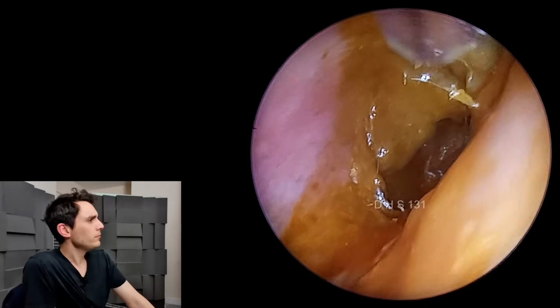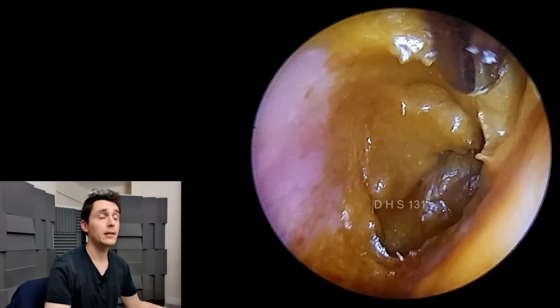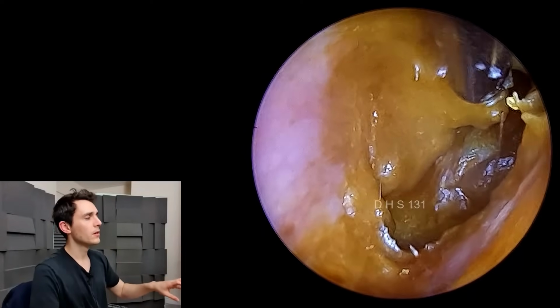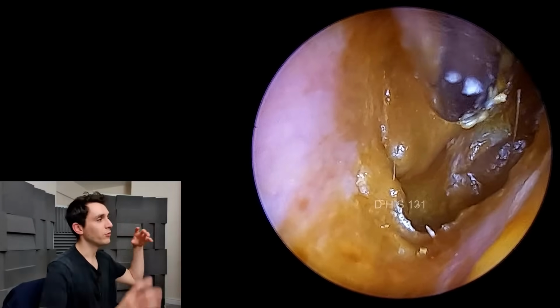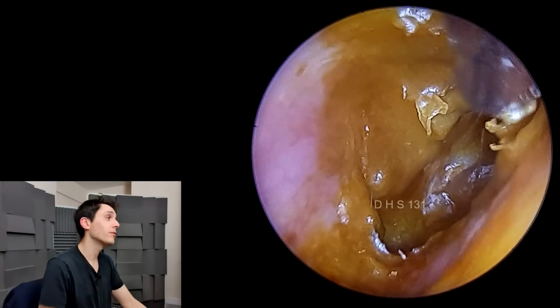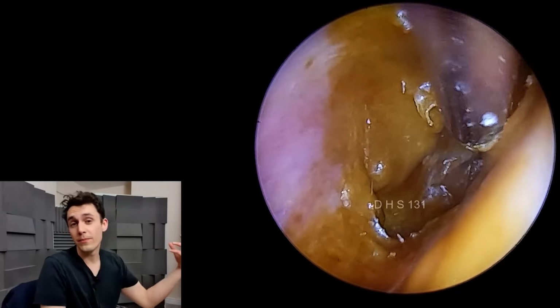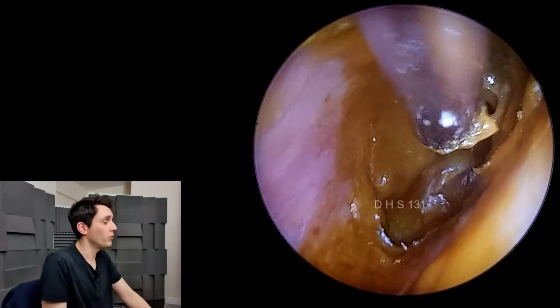But the object here, like whenever we do an infection case, is to get rid of as much dead skin and muck out of the ear as possible, not just to make the patient feel better, but also to help the treatment along a little bit. So if you just leave lots of pus and dead skin in the ear, the infection will come back. It's not really good or helpful to take medication when there's a kind of a soup of bacteria in the ear merrily eating away and feeding on that dead skin. It's just not going to work.